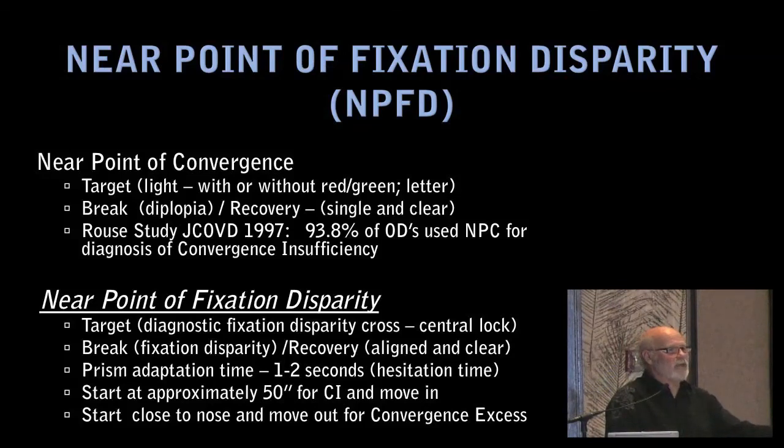And then I start to bring it back until they recover, and then I ask, is it clear and aligned? And they say yes. It's so fast that the repeatability is important. As a clinician, I don't have the time for a lot of reasons, and I don't have the attention of the patient. And it allows me to do more assessment in a very quick, effective way with a hypersensitive target.